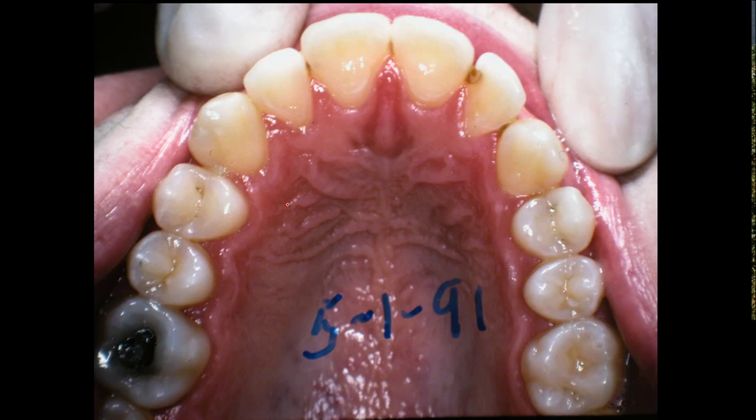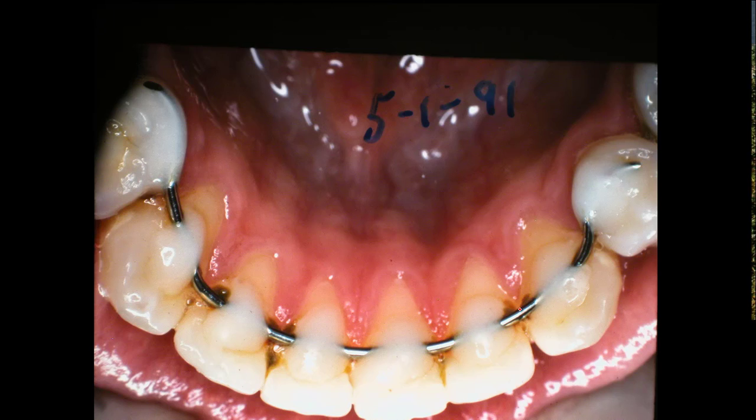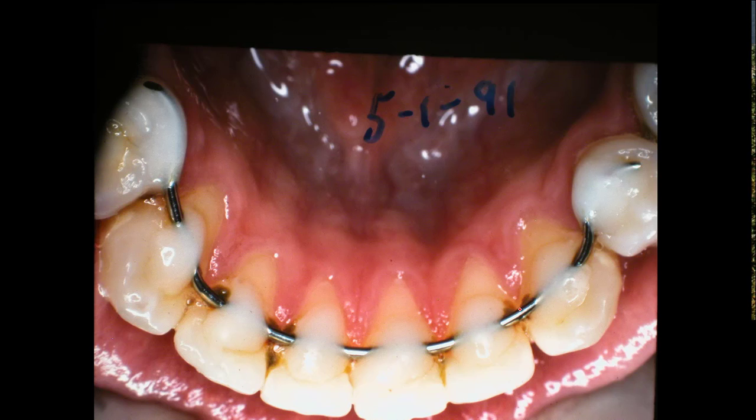Okay, here it relapsed. He's got a darn cavity right there. He needs to get into his dentist and get that done. But the 4 to 4 they left on there. This is 1991. He's back home now. He lived through it. So the lower didn't get out of line, but the tongue shoved the whole blooming jaw out, you see. He didn't look all that bad, and it's not a big deal, but I hate for him to go through life, but that's what happened. I never did get it back like I wanted it. I'm sorry. Now that's the last picture I've got of the case here.